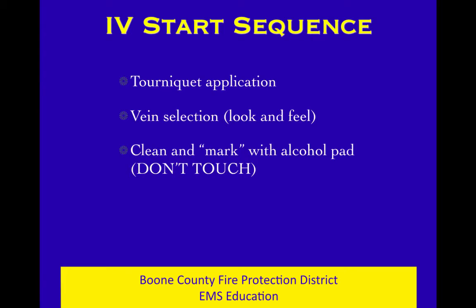You should be able to close your eyes and find a vein. We like you to keep them open to add that additional sense to it, but in a lot of cases where you can't really see anything, you ought to be able to feel something, and we teach you to find the difference between a vein and other things that you don't want to poke.